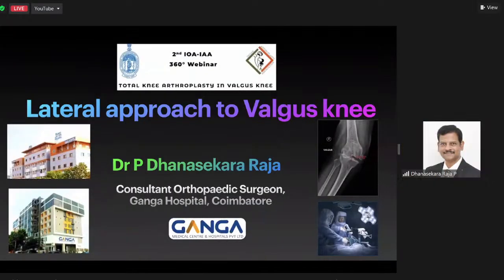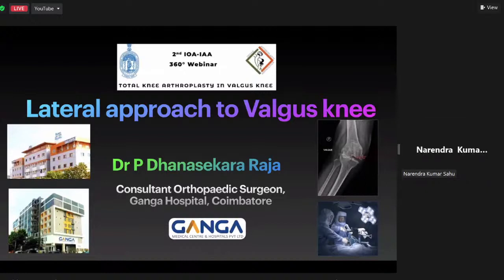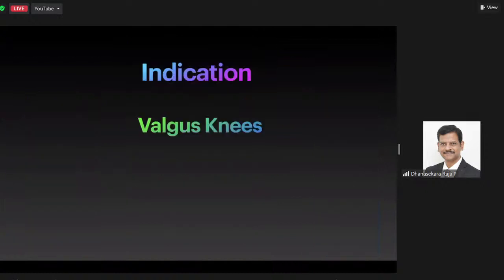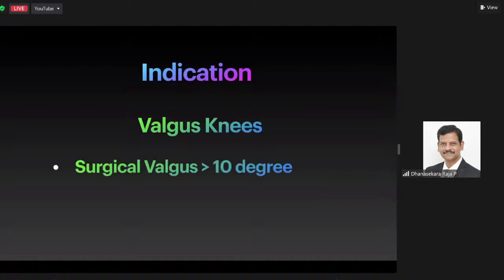Thank you, Dr. Rajiv. Good evening, Dr. Ram, our two IA past presidents, Rajiv and Subramanian Mohanty, and all the faculty. I'm going to talk about the lateral approach to valgus knee. Almost all my valgus knees I have started doing with this lateral approach because it's more convenient, and once you start doing a particular technique, you're able to do a better job with it. So otherwise, generally, I use the lateral approach. We have a surgical valgus of more than 10 degrees, which we will discuss.